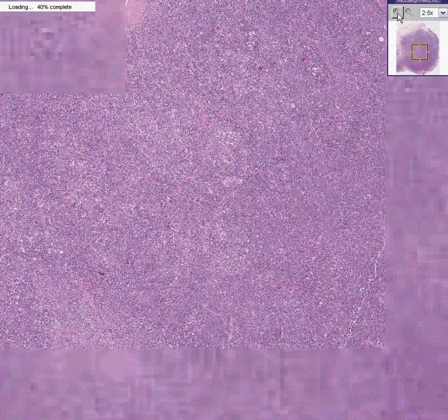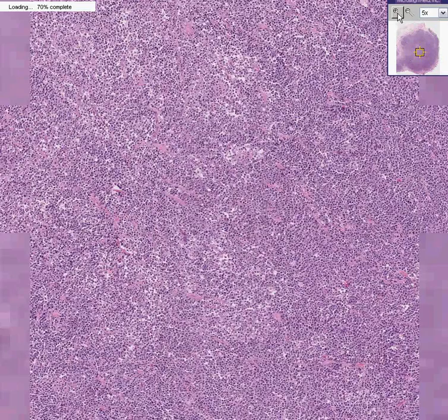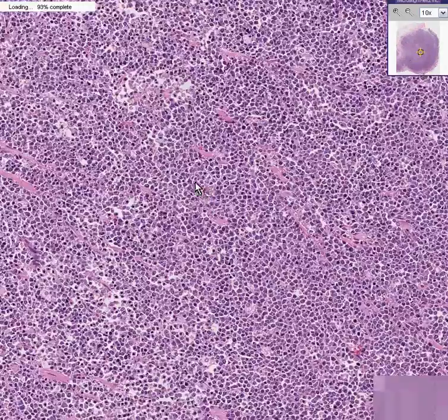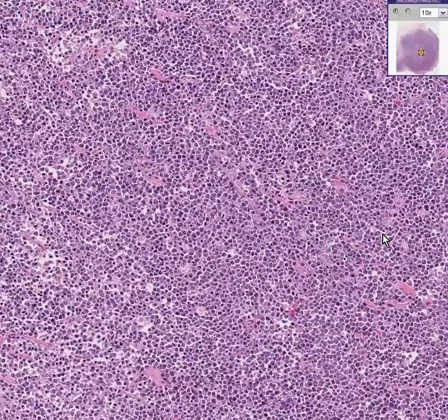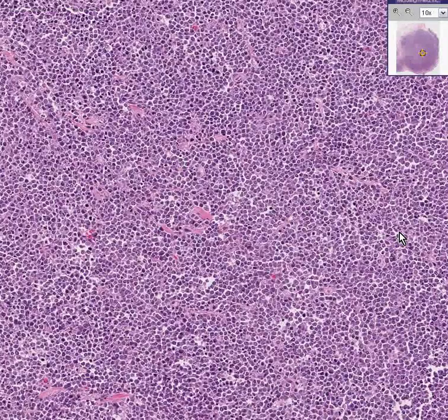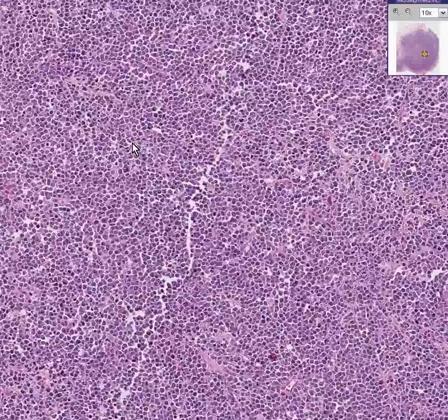This is a lymphoma. There's a lot of different kinds. But the kind that we have here is a relatively undifferentiated kind of lymphoma. It's usually found in kids. It's usually found in Africa. It's frequently found in the jaw. It's associated with chromosomal and genetic anomalies.